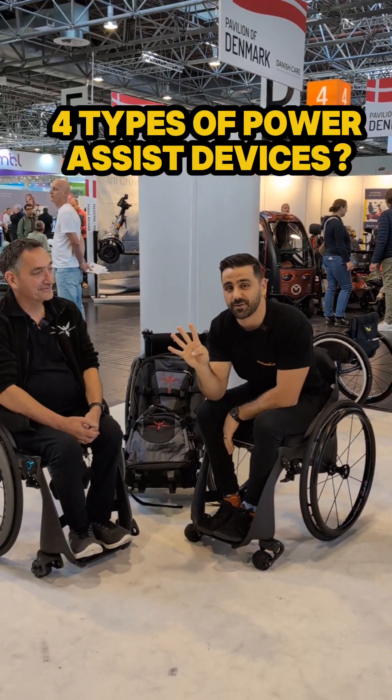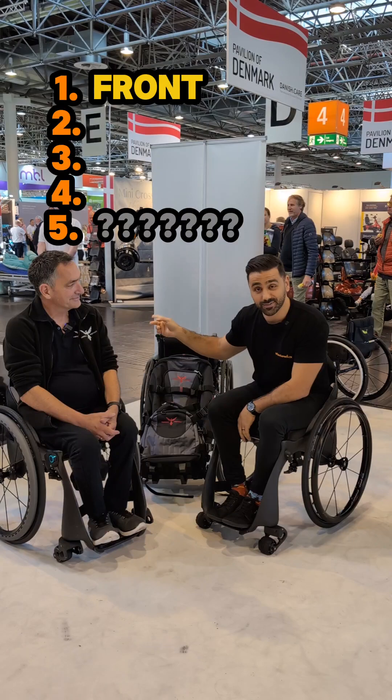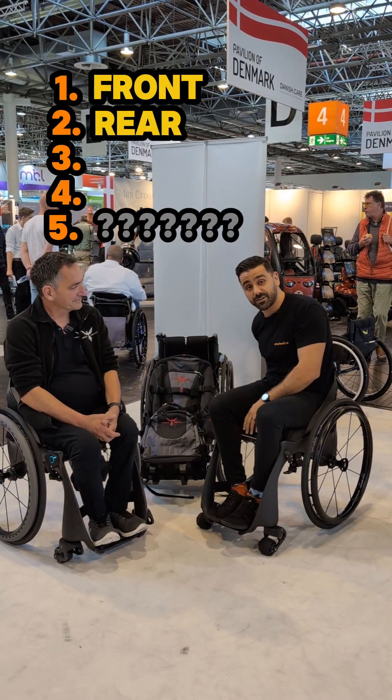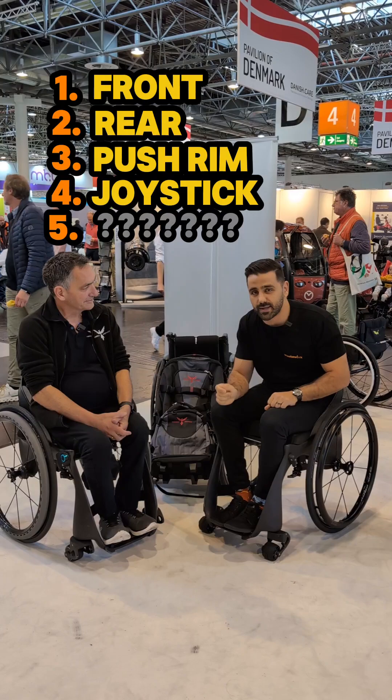There are four different types of power assist devices that you can put onto a manual wheelchair. You can do the front attachment, you can do the rear attachment that sits on the back, you can do the push-rim activated and you can do the joystick activated.